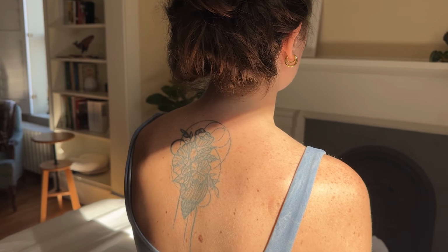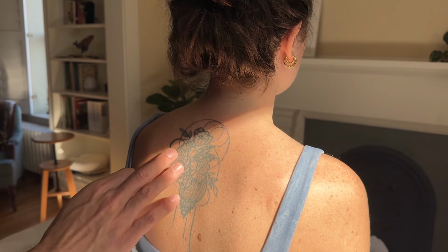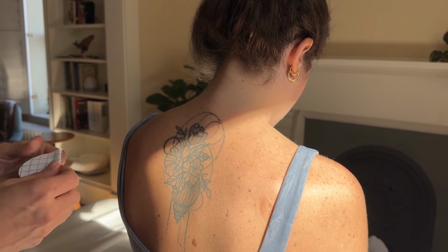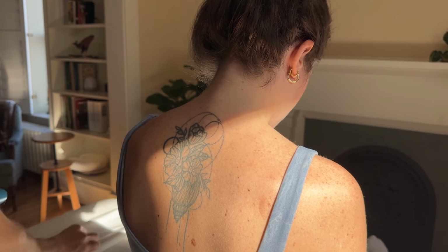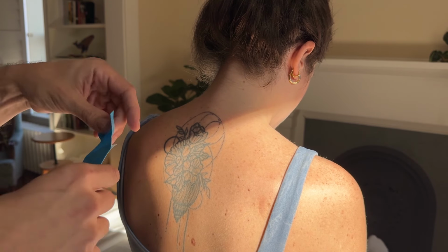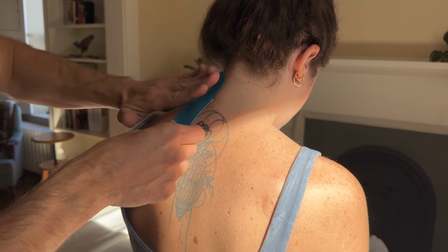For kinesiology taping of posterior neck pain, you're going to have 3 eye strips, either pre-cut or you can cut them yourselves and round the edges. You're going to get the client to forward flex their neck to stabilize the spine with the tape. You're going to break the paper off the edge of the tape and then lay it down just below the hairline, just beside the spine in the erector muscles.